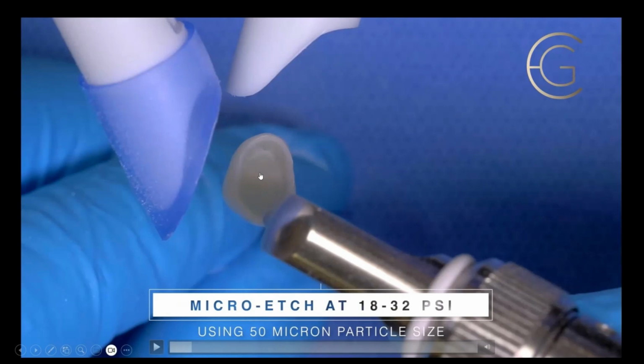Study shows that. So I always like to do a fresh etch after I've tried it in on the patient. So you're going to etch it with 30 to 50 micron aluminum oxide. Actually, the new research from Suleiman from North Carolina is showing that 12.6 psi works for all types of zirconia, and you get effective bonding.